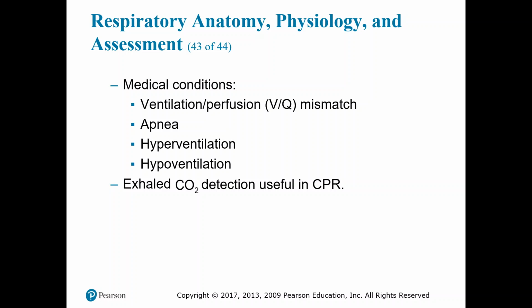And if you have a sudden return to the 35 to 45 range or a sudden increase, that is an indication of a return of spontaneous circulation. It just shows you how much difference there is between manual compressions and the actual heartbeat of our patient.